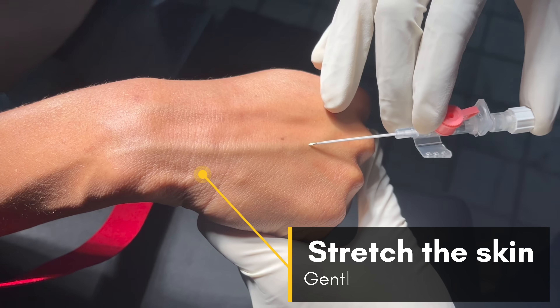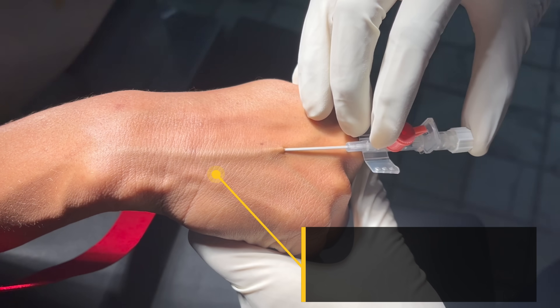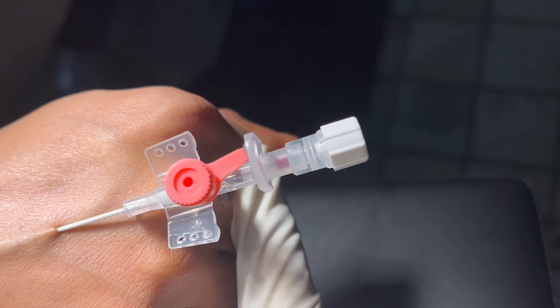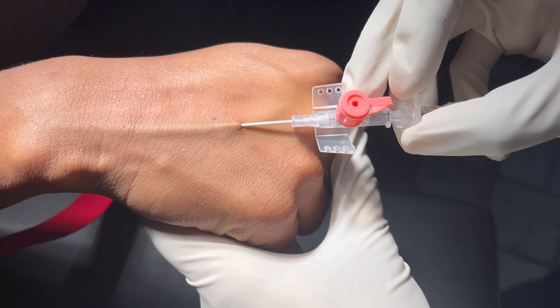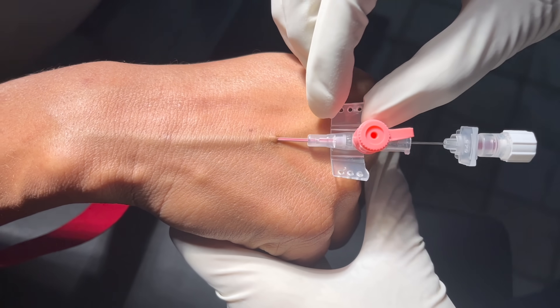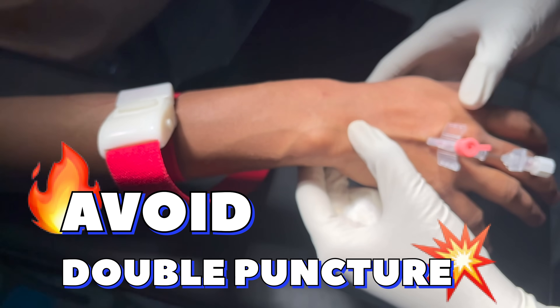Stretch the skin over the vein gently with the non-dominant hand. Insert the cannula at an angle of 15 to 30 degrees to the skin. Successful cannulation shows filling of the needle and the flashback chamber with blood. Now partially withdraw the needle and advance the catheter into the vein. Advancing the needle further can lead to double puncture of the vein.